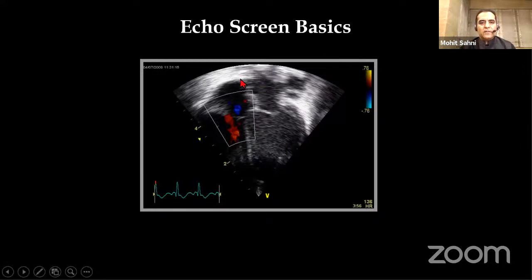So what it is showing is a basic echocardiography window, and this is the probe. This is an echo probe, a phased array probe, which we also call a sectoral probe. In this sector, you see this is your probe orientation marker. And this is what an optimized view is: if the structure of the heart covers around 60 to 70% of the sector, it is adequate and considered to be optimized. Ideally, all echo machines should be hooked up to the monitor with ECG leads to get the ECG. This is for the advanced level; if you don't have it, it's fine.